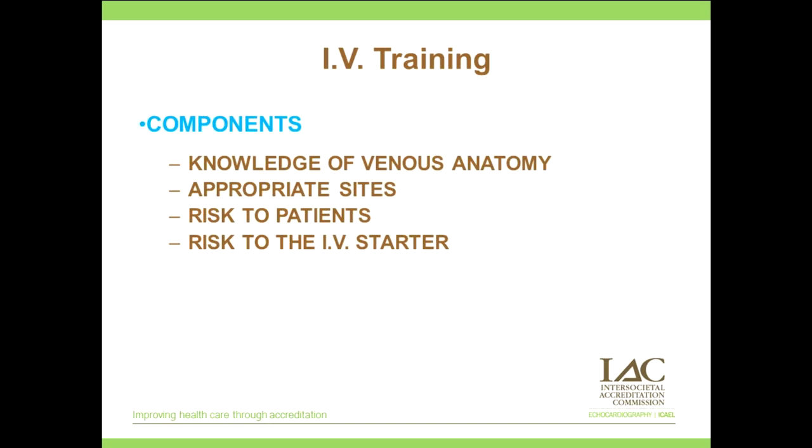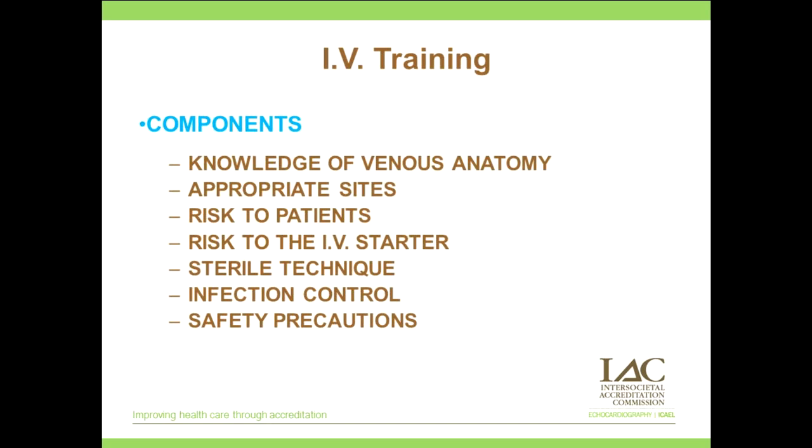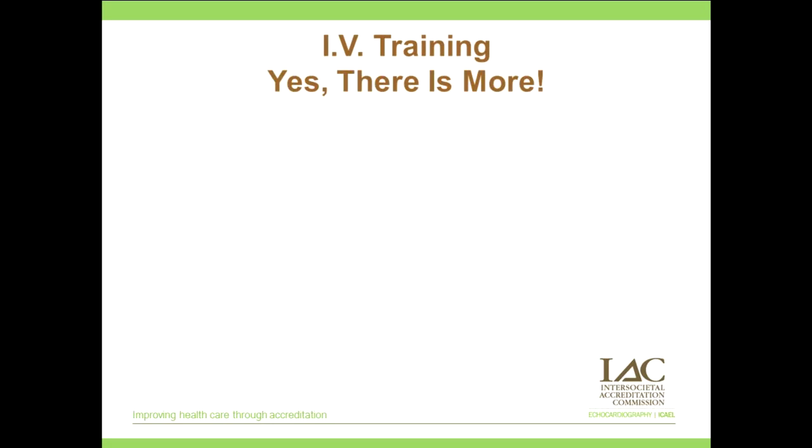Sure. You want to take every possible step not to introduce blood to your skin. You also want to make sure you know sterile techniques, infection control, and safety precautions. Knowing the sterile techniques, infection control, and safety precautions will help ease the risk to the patient and the IV starter. So with IV training, once you have the IV in place, the training should go over techniques to let you know that you were successful. And of course, it should also include proper removal of the IV catheter.